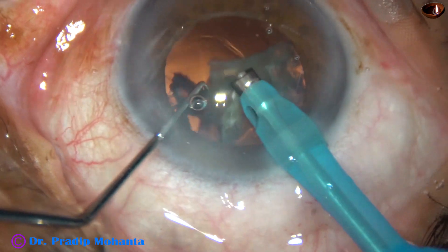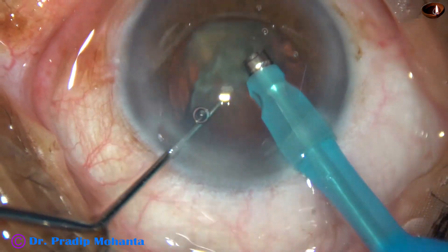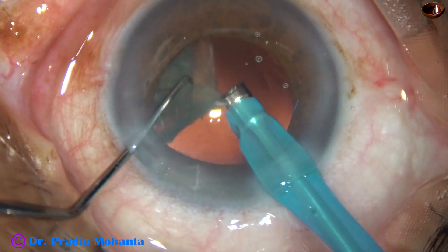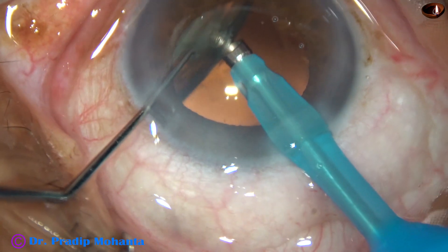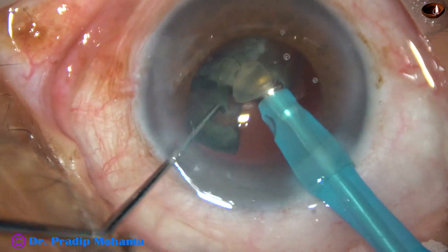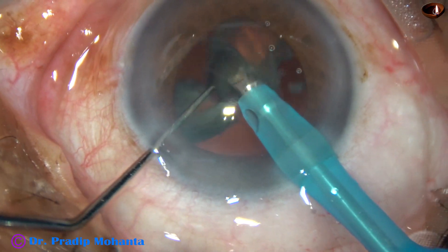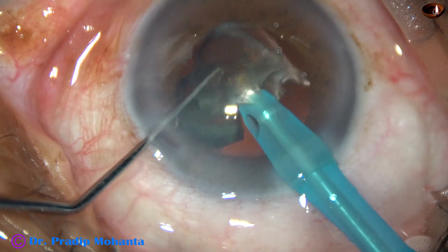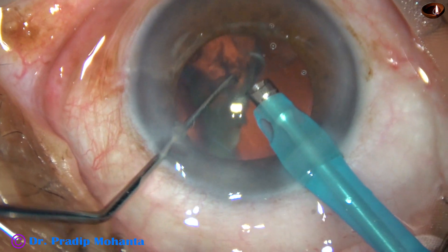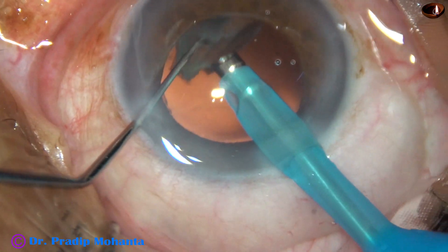At this time, you can notice that the pupil has started becoming small. So all these challenges we get in case of pseudo-exfoliation: small pupil and weak zonule. And in this case, the nucleus is quite hard. So all challenges together can be there.